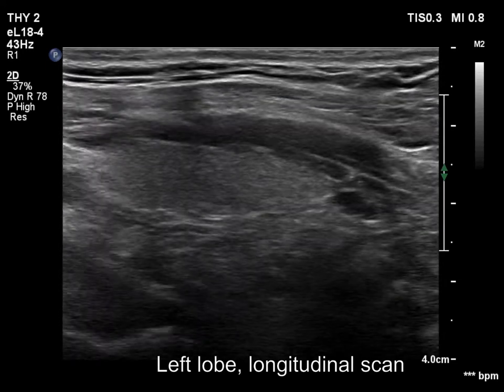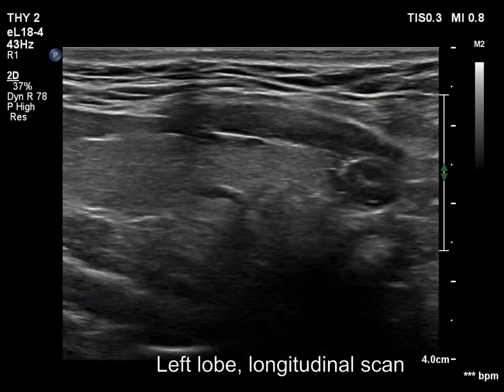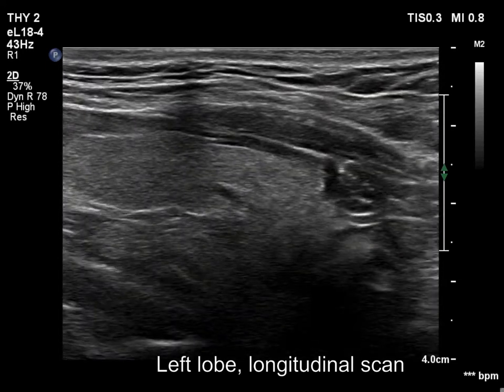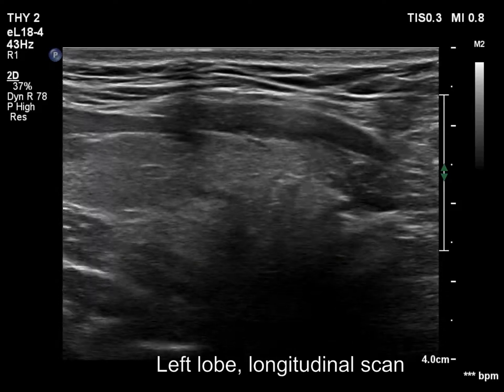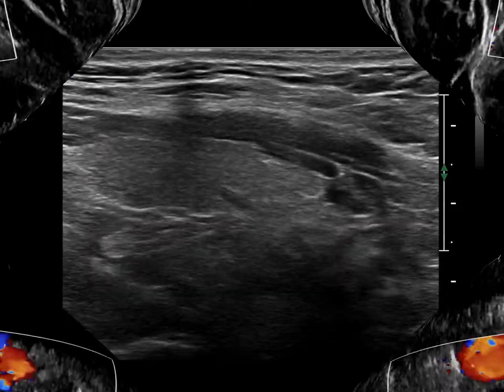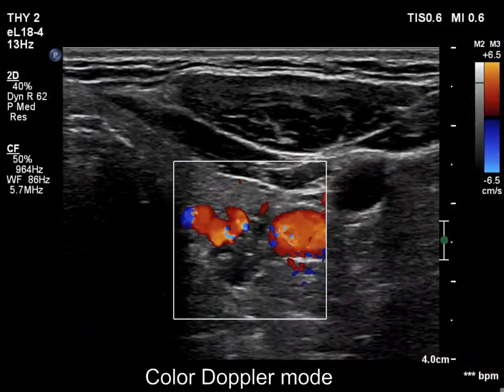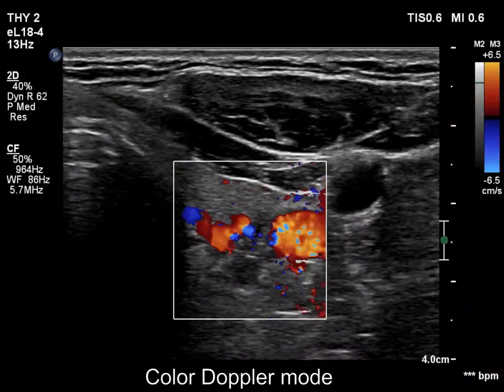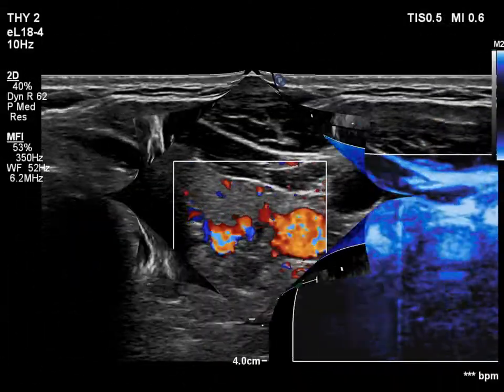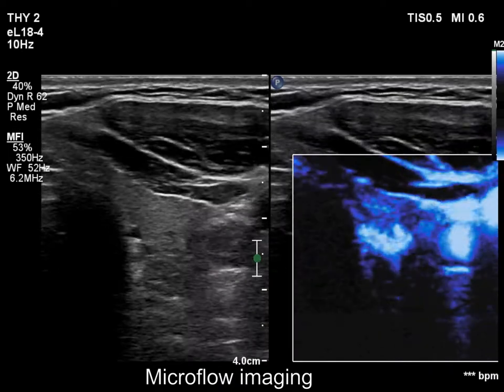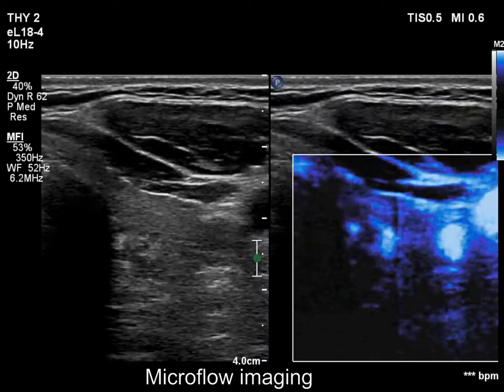The parathyroid adenoma is clearly outside and inferior to the left lobe. The vascularity is not specific.